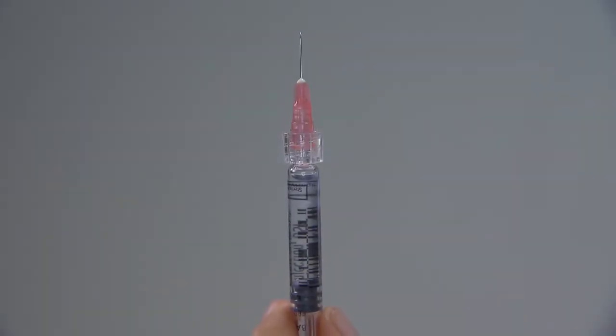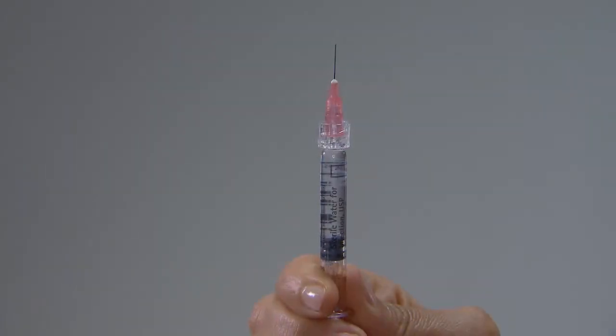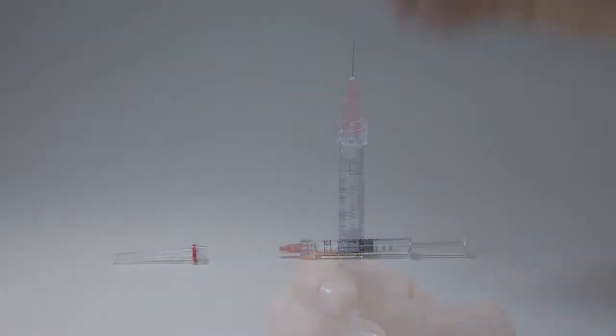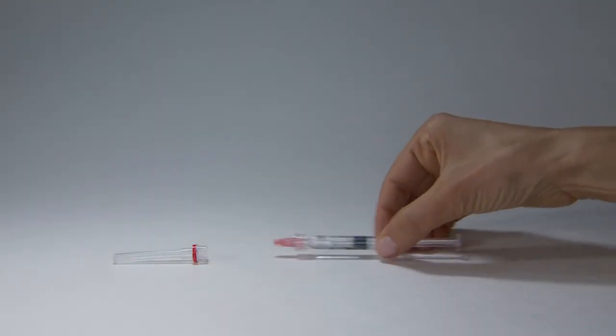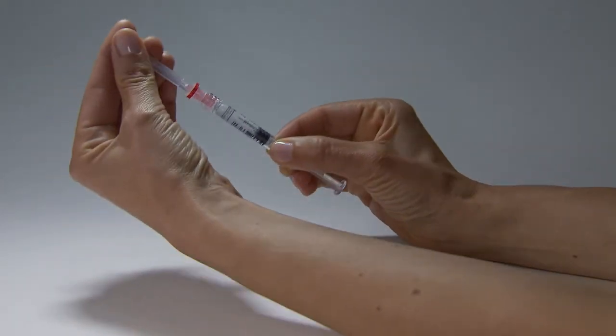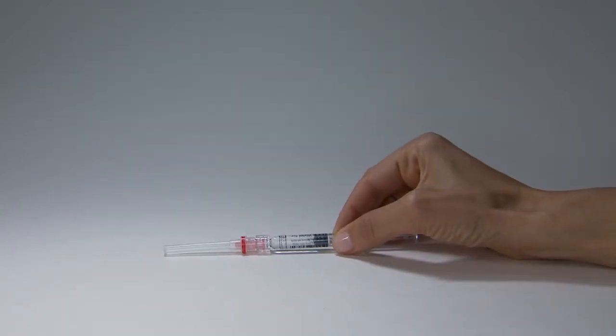With the syringe pointing upward, gently tap on the syringe. Slowly push the plunger until all of the air bubbles are gone. A drop or two of liquid will appear at the end of the needle. Carefully recap the needle and lay the syringe on a clean, flat surface. The syringe is now filled with the prescribed dose of Gonal F RFF and is ready for administration.